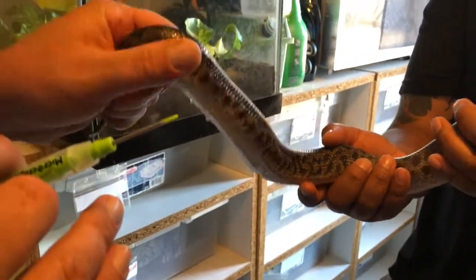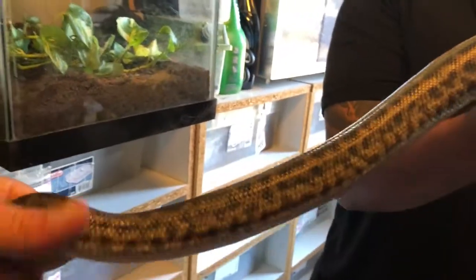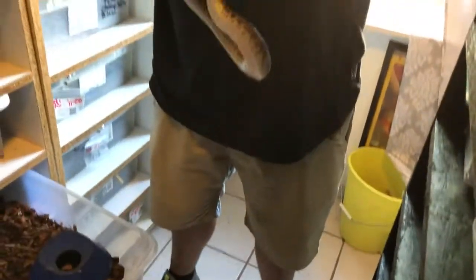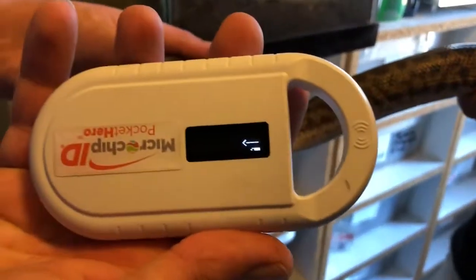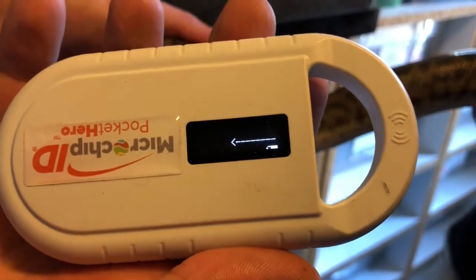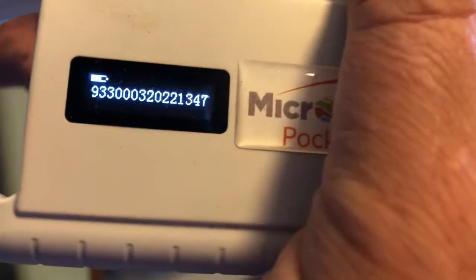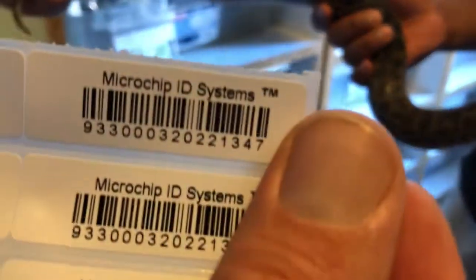Rub it a little bit to seat the microchip so it's fully in there. Then grab the reader — the microchip reader — scan it and it picks up: three four seven. We verify her with three four seven, then we'll write 'spider python' on her and link that number up.